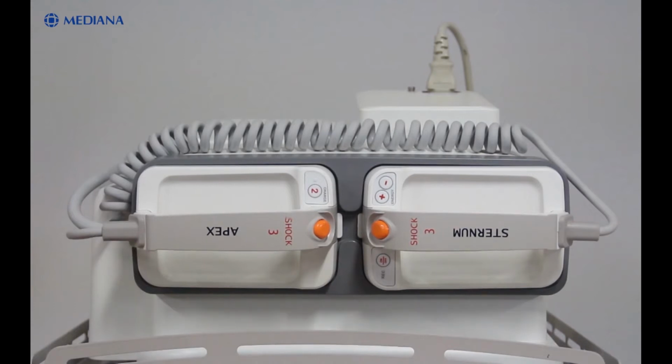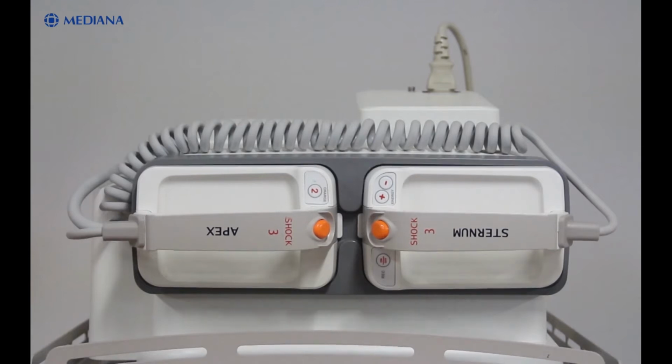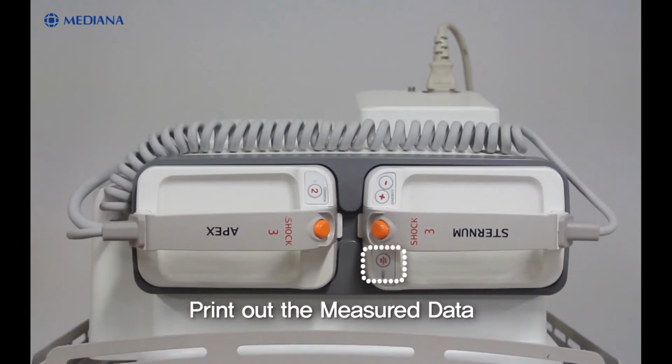So with these 4 buttons on the paddles, you can adjust desired energy level by pressing the plus and minus buttons, charge and deliver the energy, and finally print out measured data by the record button.